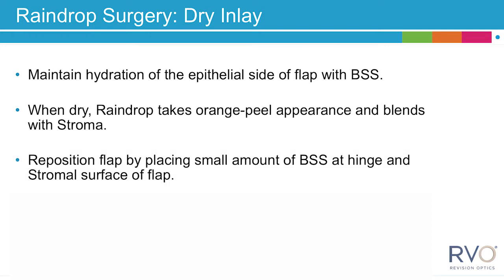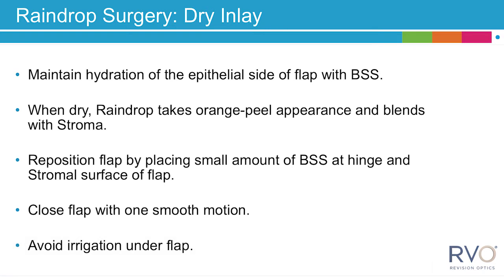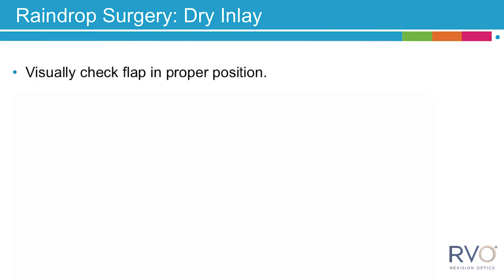Reposition the flap by placing a small amount of BSS at the hinge and stromal surface of the flap, then close the flap back with one smooth motion. Avoid any irrigation under the flap, as this may cause the raindrop near-vision inlay to become misaligned, damaged, or lost.